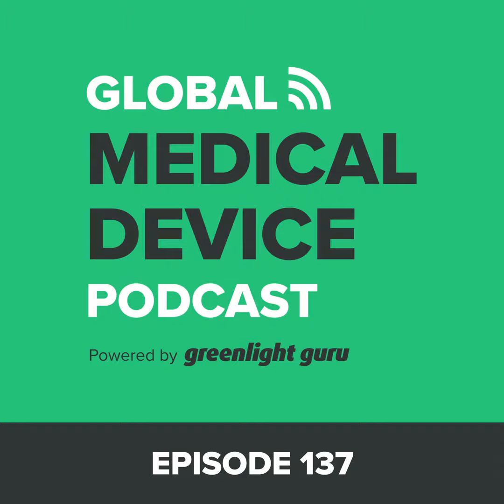A consensus standard is something that's developed by the private sector. So like you said, it's not developed by the FDA, so it's not a regulation, but it's something that the FDA suggests that you use. Using it is voluntary, and it's basically an alternative procedure to address some of your software development needs.